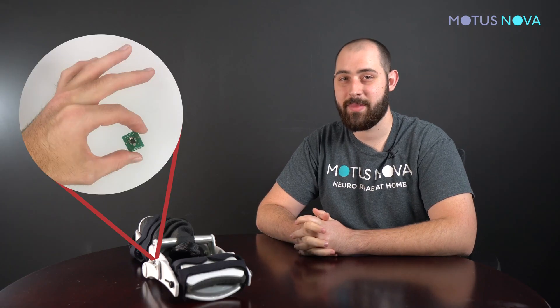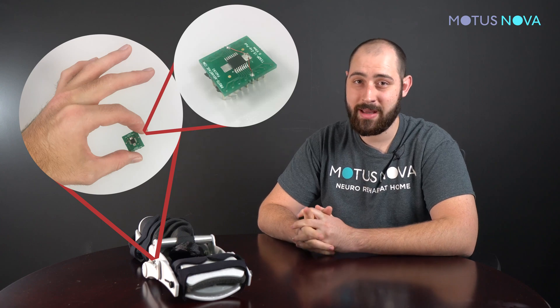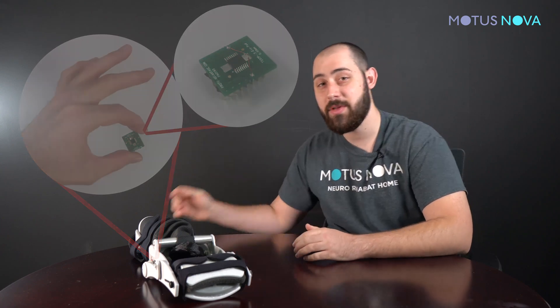To give you some background, here at Motus Nova we make robotic devices that facilitate the regaining of function for brain injury survivors in their very own home. The angle sensor inside of the Motus hand and foot measures the angle of your wrist or ankle in real time and communicates that with the Motus screen.